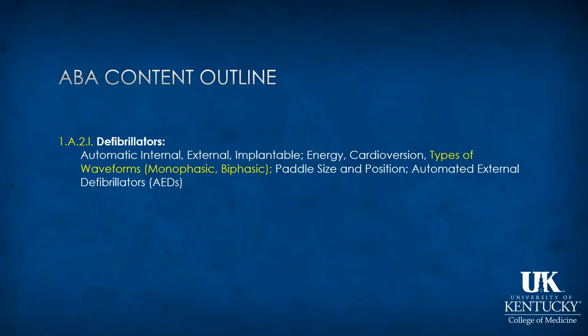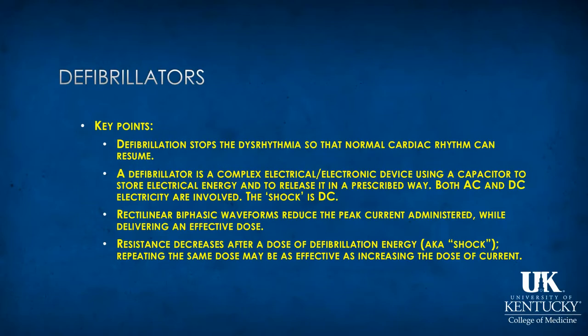Our ABA content outline gives you a few keywords to hone in on, and I'll attempt to address some of this, although it's pretty dry stuff, and I think your own individual reading is going to be key. I'm going to bring up a few key points here. And defibrillation is a treatment that stops the dysrhythmia, ventricular fibrillation, so that normal cardiac rhythm can resume.